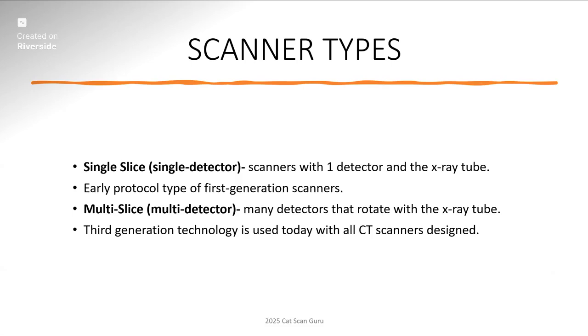This is many detectors that rotate with the X-ray tube. Your third generation technology is used today with all the designs of CT scanners. Every CT scanner out there on the market is based off of this technology.